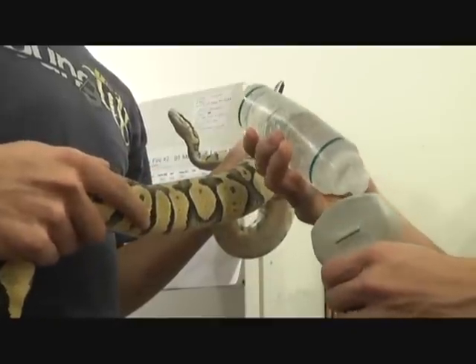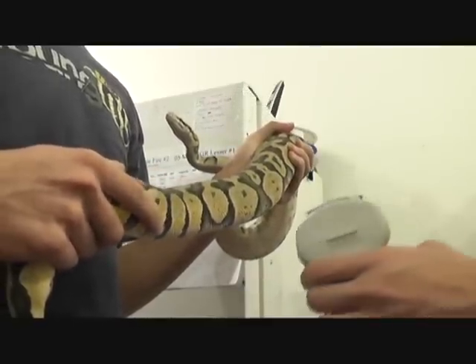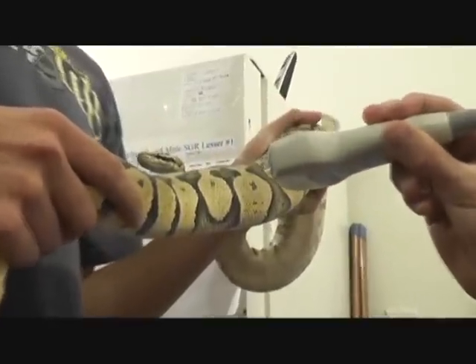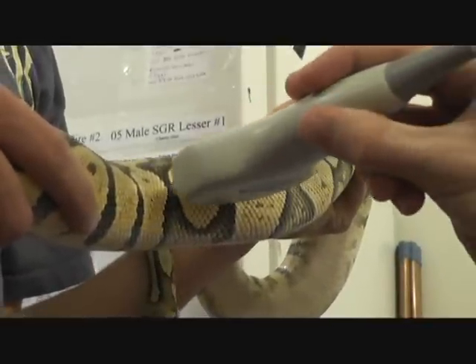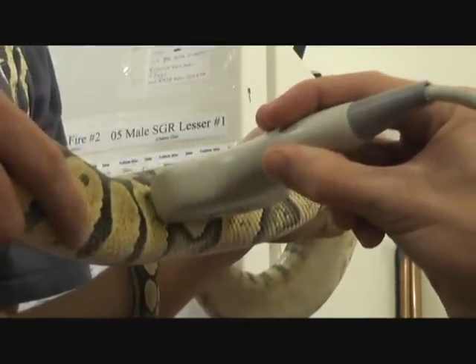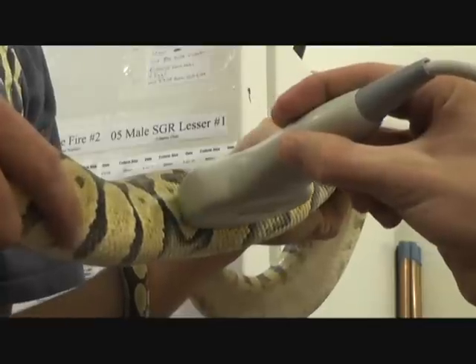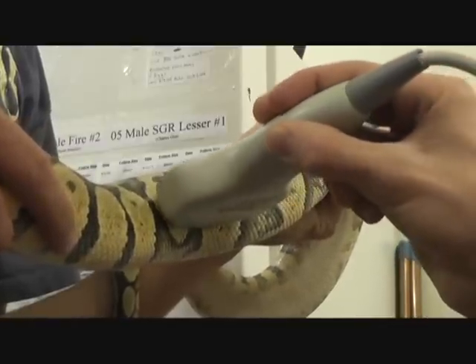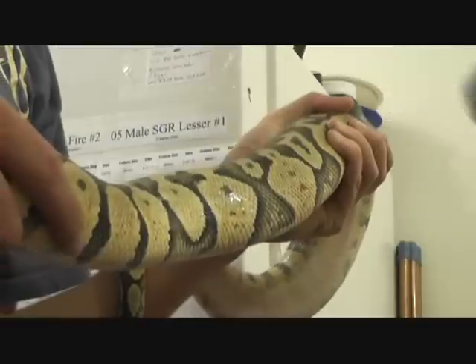As you can see with the probe, we just put the jelly on, which that's not too difficult. We'll try to keep it as close as we can so you guys can see on her. Justin just puts it about a third of the way up from her tail, and he scopes back and forth to find the follicles. We just keep moving around until we find them, which we just did.